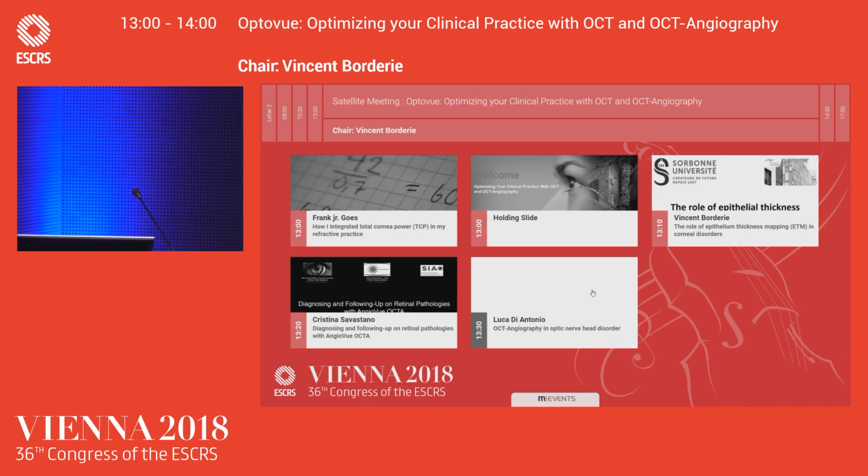About the second question, by OCT angiography, we can't see the leakage effect. We have to think about OCT angiography as totally different from fluorescein angiography, because OCT angiography, on all devices, studies the flow analysis inside the vessel. When we use fluorescein angiography, we study the indirect signs. So by OCT angiography, we can see the silhouette of vessels, but not the leakage.